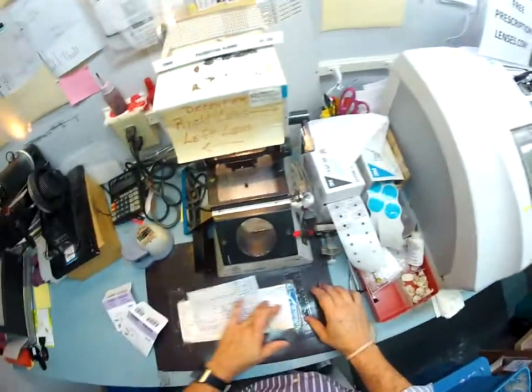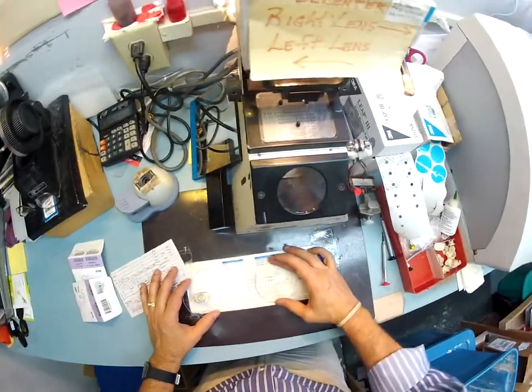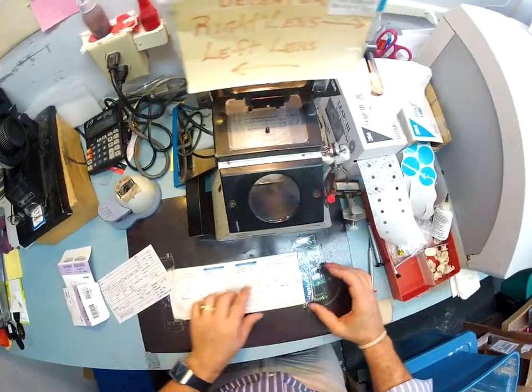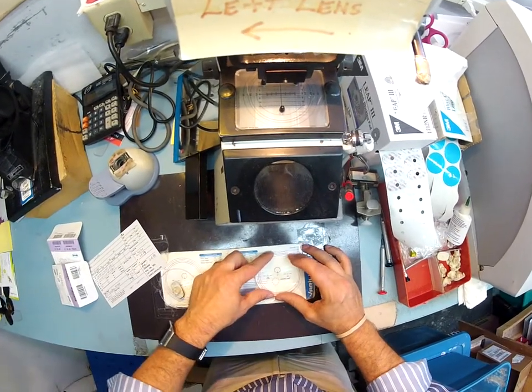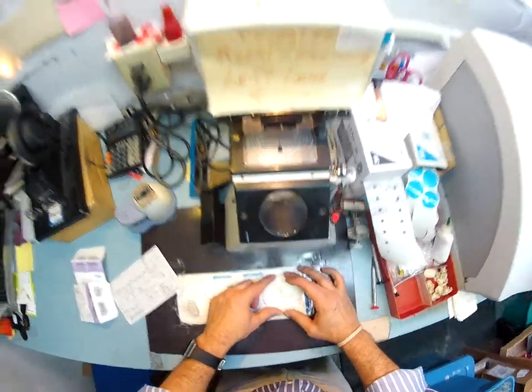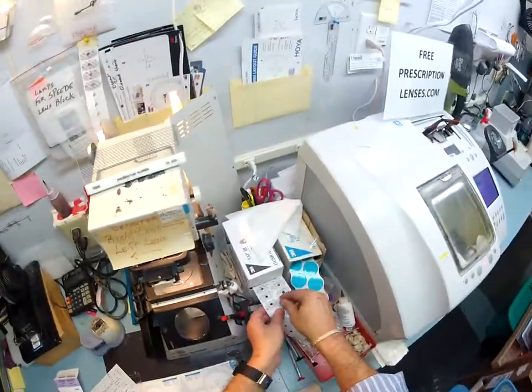And what you cannot see is I have crosshairs, if you will, a vertical meridian and a horizontal, and I'm getting your lens in there just perfect, lined up. If that was that dot that I have to center it on, that's why I'm using those dots to get it oriented just perfect, the vertical and the horizontal. So let me do that.